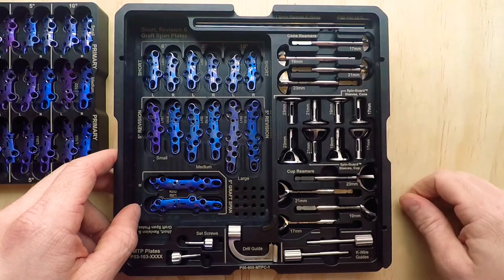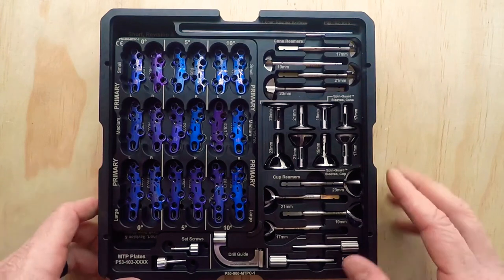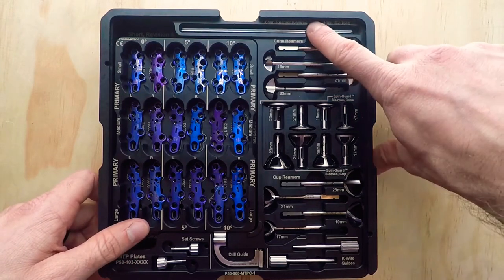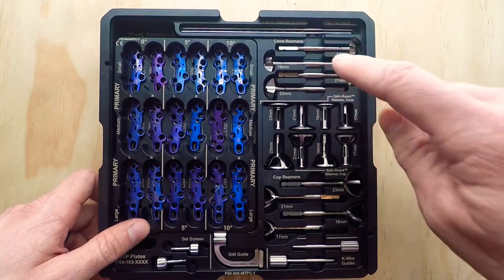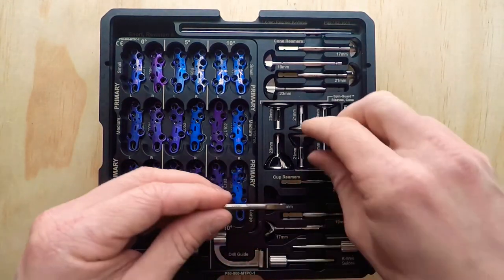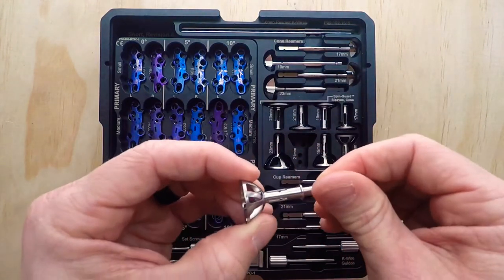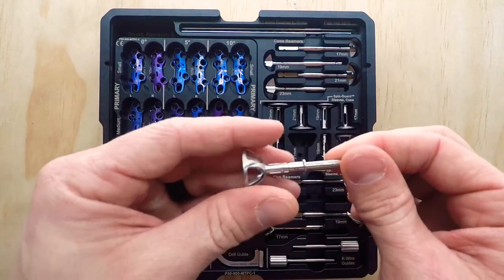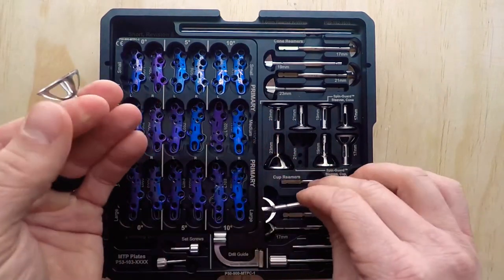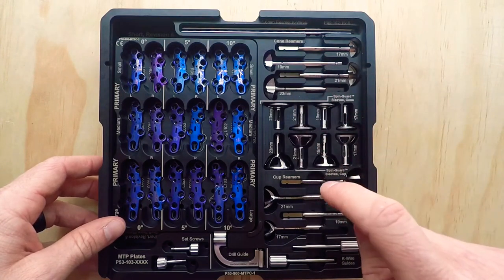Over here we have our instrumentation. You're probably familiar with cup and cone reamers — not every company offers these in their sets, which is surprising, but we do. We have K-wires that work with our cone reamers and cup reamers, with matching sizes. One cool feature — not necessary, but simply available — is we have reamer guards that connect to the reamers so you can protect surrounding tissue and bone while spinning the reamers at high speed. Those are offered for both the cone reamers and the cup reamers.